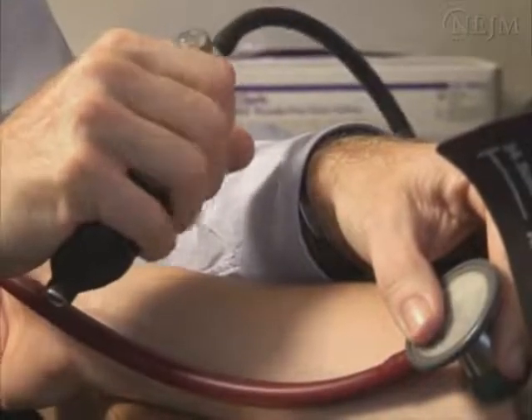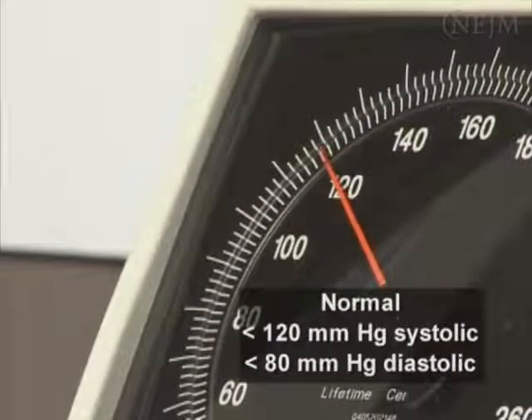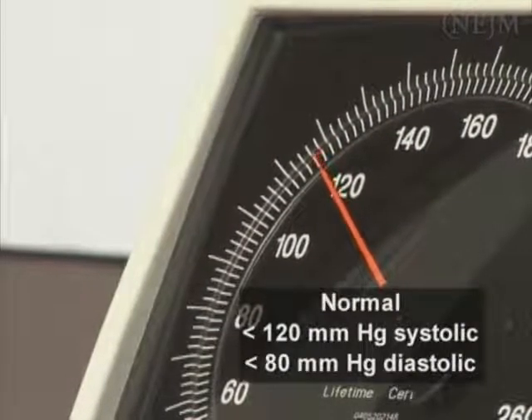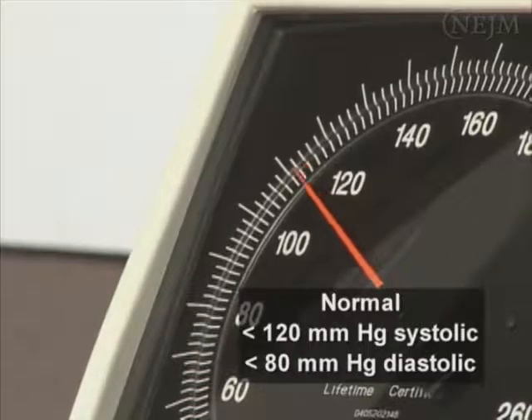In the routine outpatient setting, blood pressure is measured indirectly. Thus, it is important that proper techniques be used in order to produce consistent and reliable readings. In adults, a normal blood pressure is less than 120 mmHg for systolic and less than 80 mmHg for diastolic blood pressure.